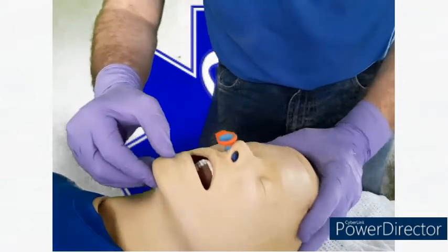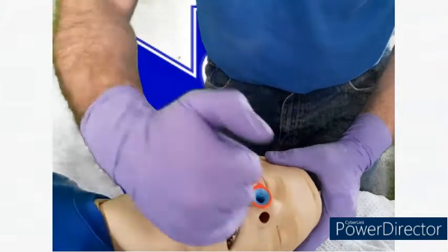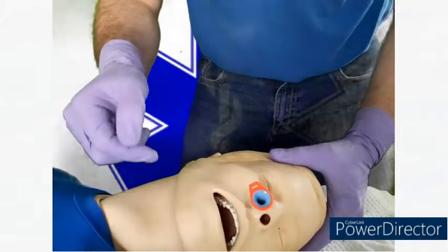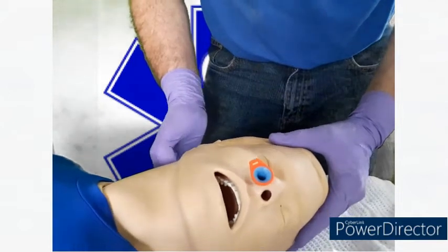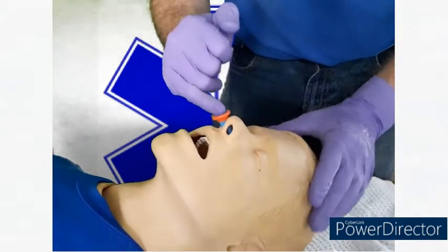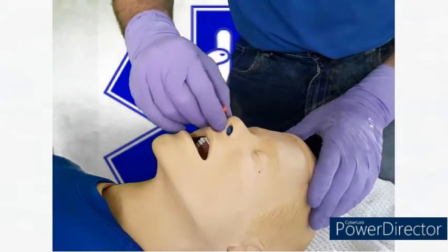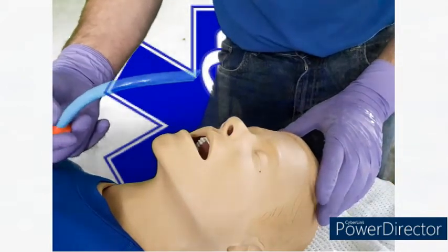But if we look into the airway, and I don't know if you can see it in there, but we can see it at the back of the oral pharynx there. So that's a nasal pharyngeal. We could put one in each side. If the patient didn't like it, we could remove it by sliding it out.